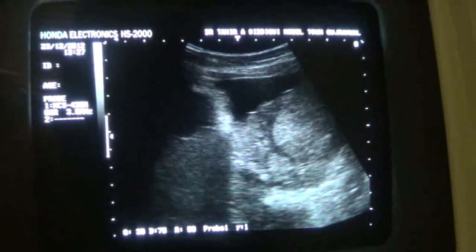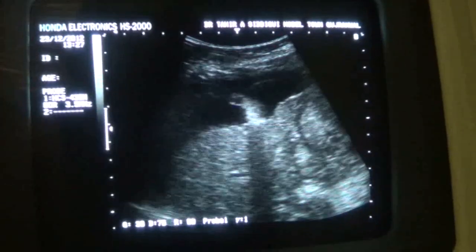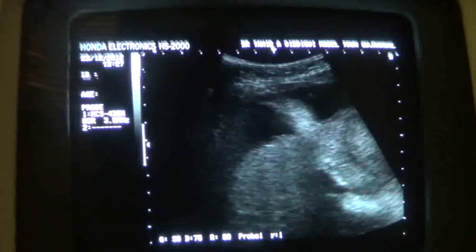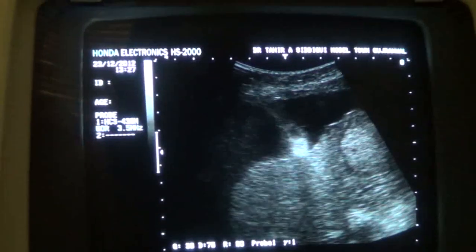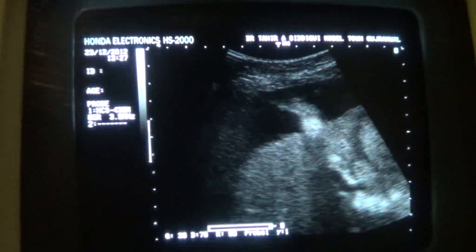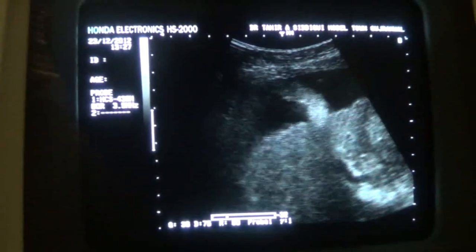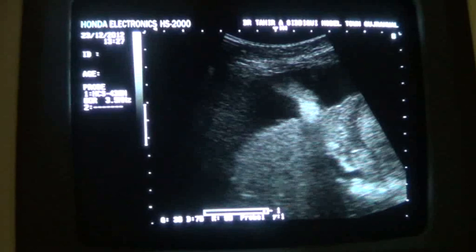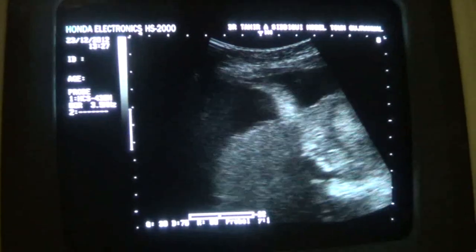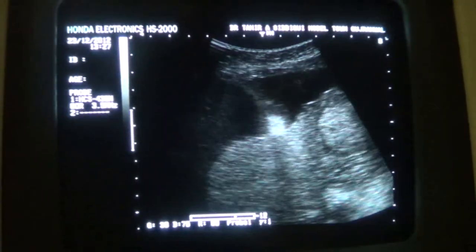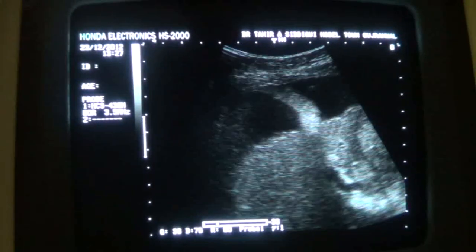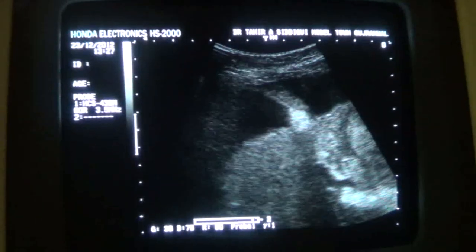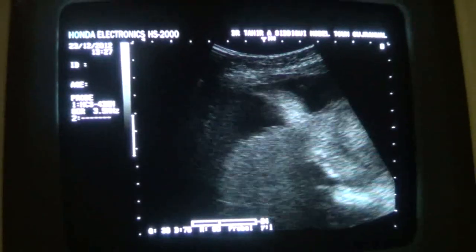See its movement. This is the falciform ligament, and it is really seen in cases of moderate ascites or moderate to massive ascites.